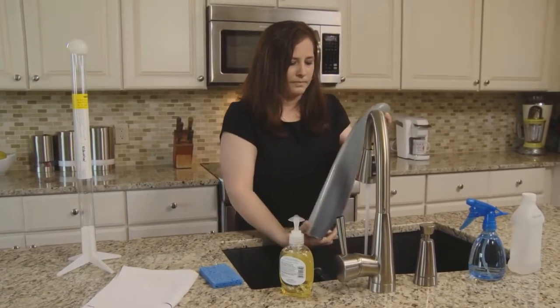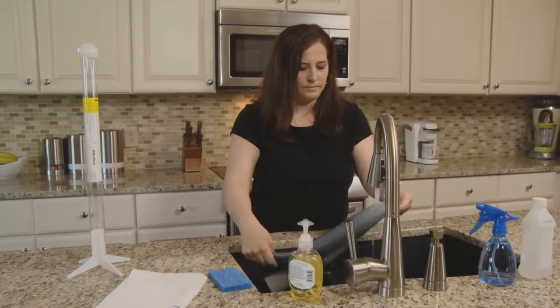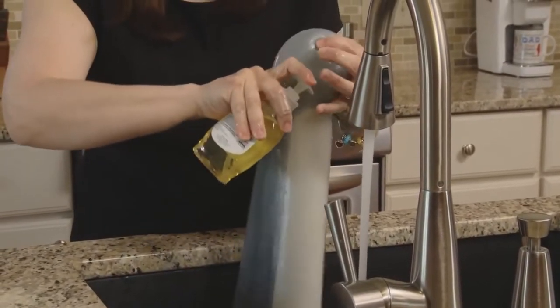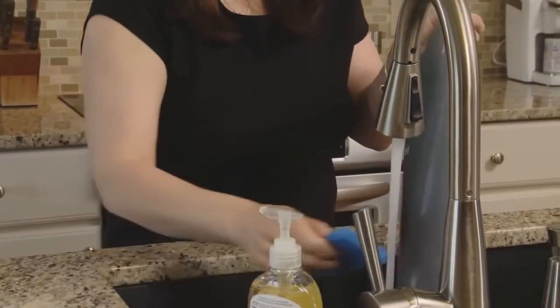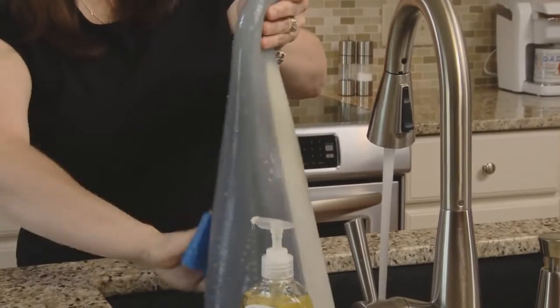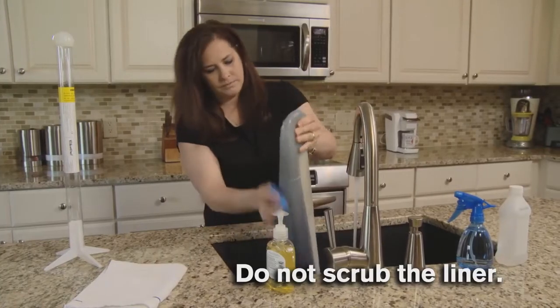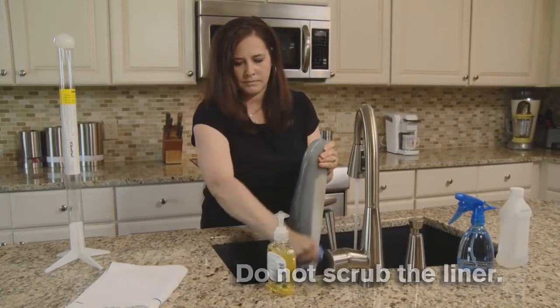Clean the gel side of the liner thoroughly with lukewarm tap water and a body soap that does not leave a residue. Please be aware that, for some amputees, antibacterial soap has caused skin reactions. Apply the soap with a clean, soft cloth or sponge. Take care not to scrub the Alpha Liner. Scrubbing can roughen the surface of the liner, which can then irritate your skin.